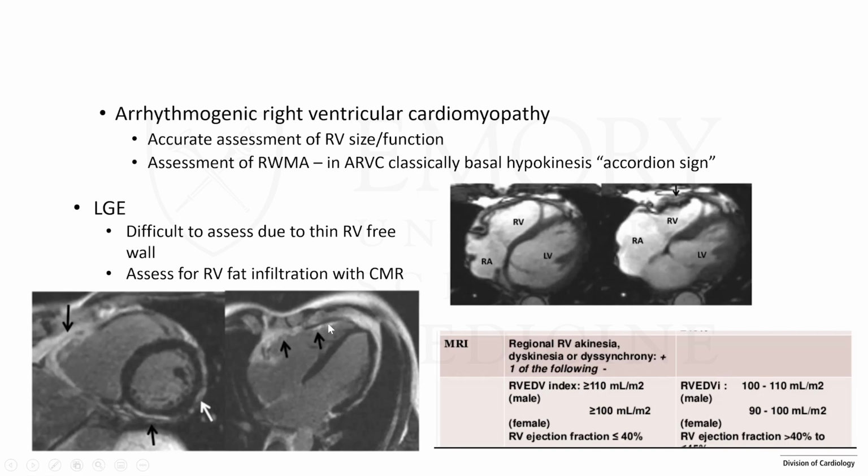You can also do fat saturation images where you're looking for where fat will light up on MRI, which is the hallmark of ARVC, that replacement of the myocardium with fatty tissue. So you can do fat saturation images as well if you're looking specifically for ARVC.